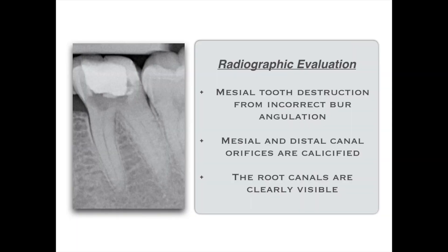What you see here is the patient's x-ray. This patient was referred to me to complete the root canal treatment, and it was clearly visible in the x-ray that the previous dentist had made an attempt to initiate root canal treatment but unfortunately couldn't find the canals. The first thing we need to do is radiographic evaluation — it's very important you read the x-ray before you attempt treatment. What I see first is mesial tooth destruction, probably from incorrect angulation of the burr when the previous dentist attempted the root canal.